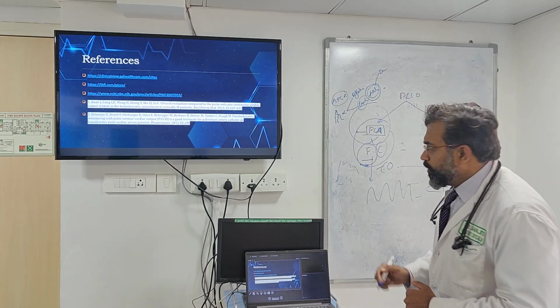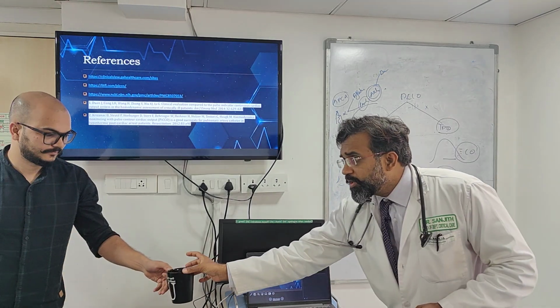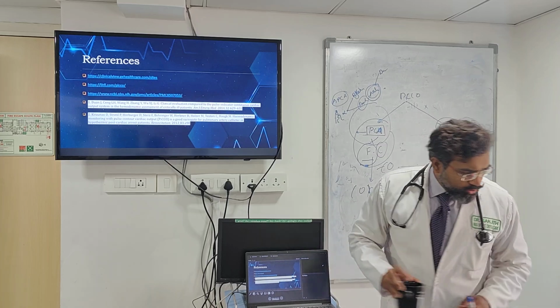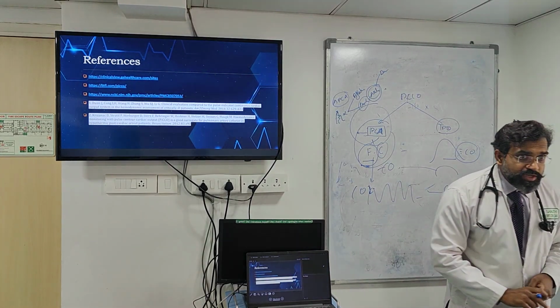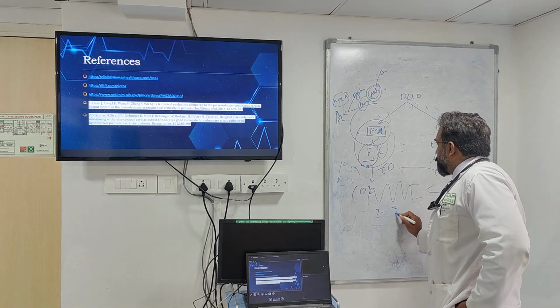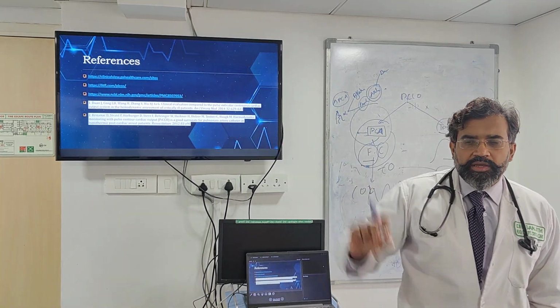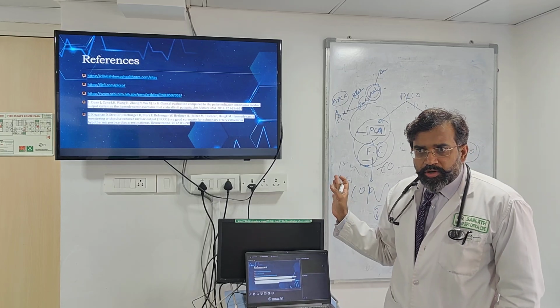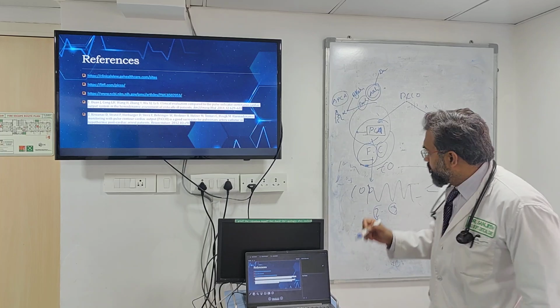For example, you had a cardiac output of 2, and now it has become 2.3. Now the cardiac index was 2, it has become 2.3. It's a 15% change, isn't it? It's a big change, right? Say it became 3. The cardiac output I was seeing 2 all the time, now it has become 3. It is a big change that has occurred. Is this reliable or not? That's the question. For that, I repeat the thermodilution.